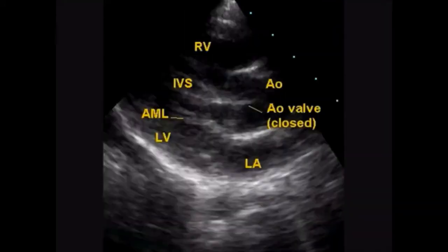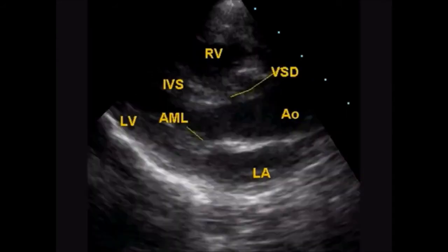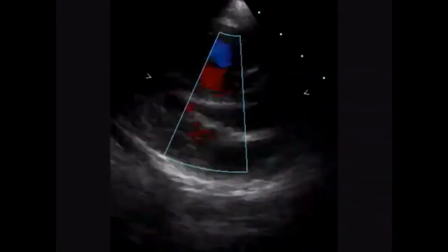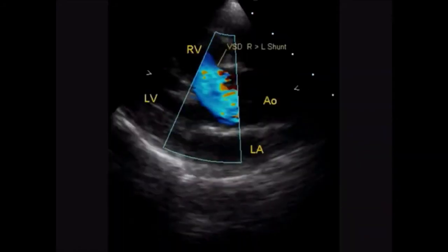This is the parasternal long axis view in tetralogy of Fallot. Aortic valve is seen in the closed position. You can see the ventricular septal defect, which is sub-aortic, and you can see the right to left flow across the interventricular septal defect, which is blue in colour.